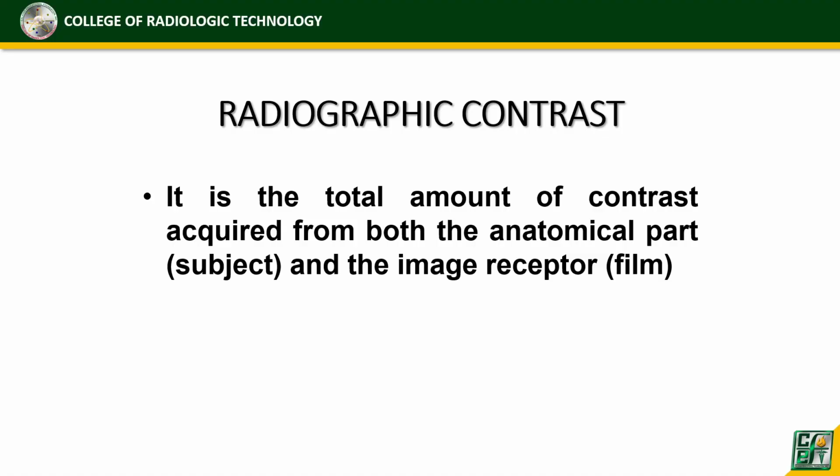Okay. So when we say radiographic contrast, it is the totality or the total amount of contrast sa ating field. It is the combination of both the subject and the film contrast. Pag sinabing radiographic contrast. Okay? So there are two types of contrast, di ba?